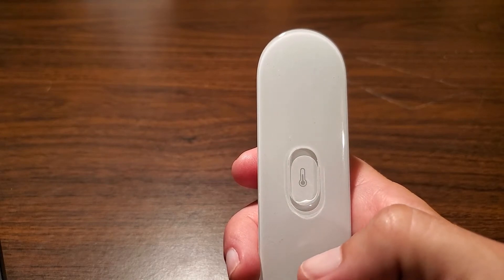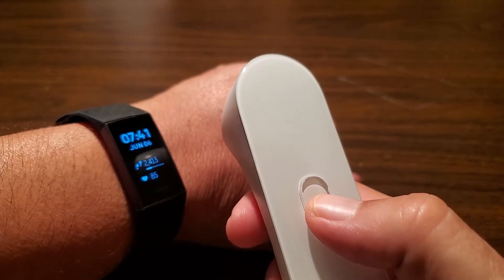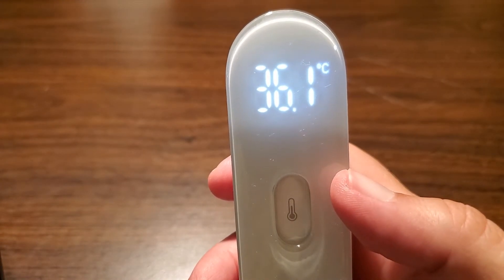That's it — let go. So now if I take my measurement it should be in Celsius. Let's give that a try. I'll move my hand about an inch away, press and hold, and there you go — 36.1 Celsius.